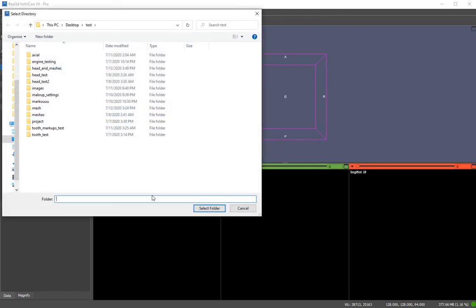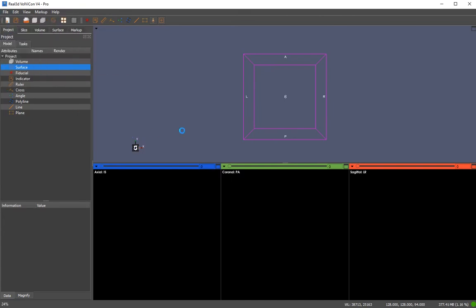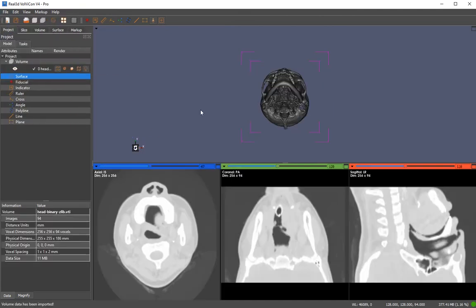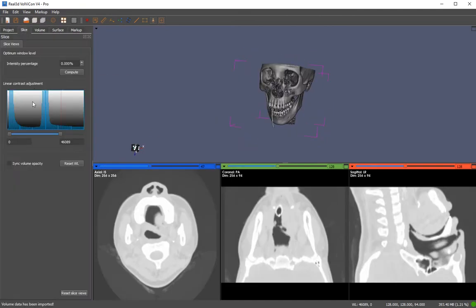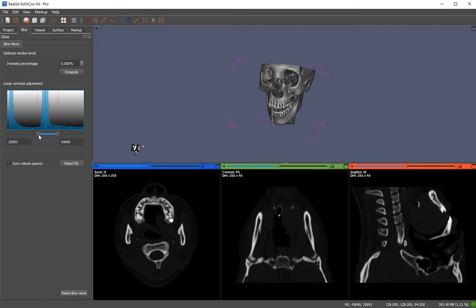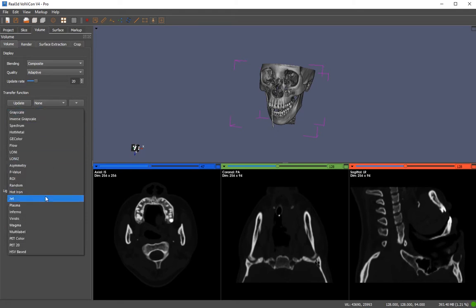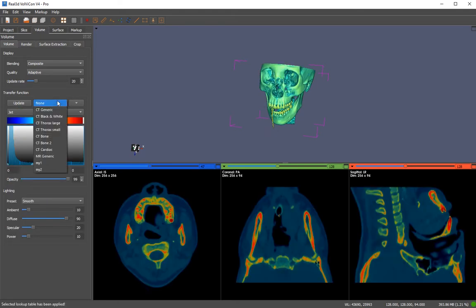You can import a series of images by selecting the folder that contains the image stack. Let me import a model, adjust the window and level for brightness and contrast, and set the lookup table.